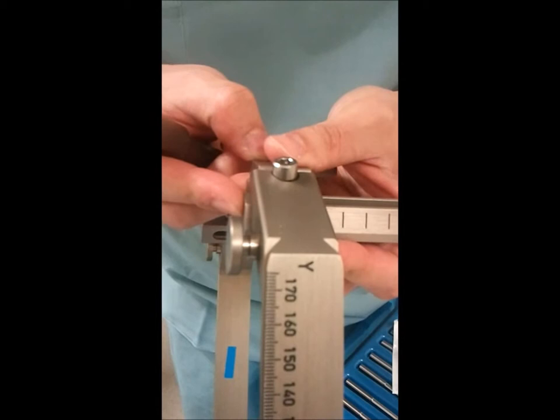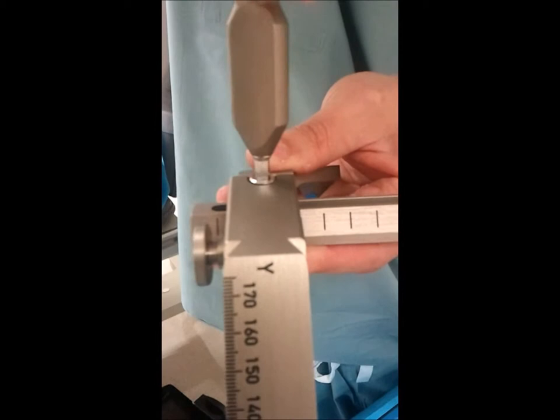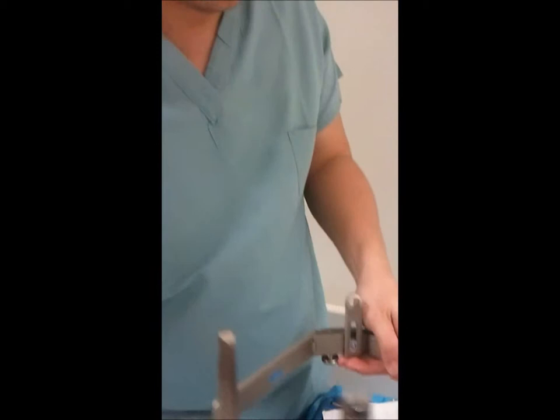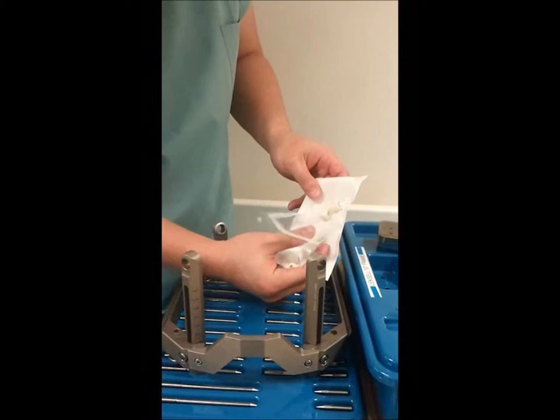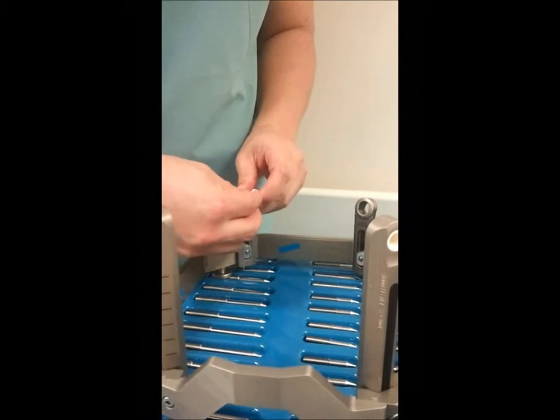That's all the way superiorly with that post, then sliding it back down and getting it on a line so it's consistent on both sides. That usually will give you, for an average size patient, a good target.